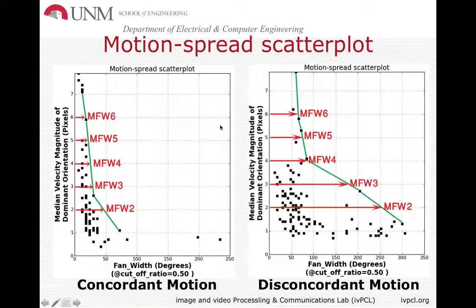Okay? In this case, we're looking at statistics over the entire video. These are computed, each little point captures the median velocity over different frames. And we have this scatter plot. These are the patients that are more or less stable and far less critical to transport to the hospital in terms of the plaque. In this case, the motions are concentrated to the left.